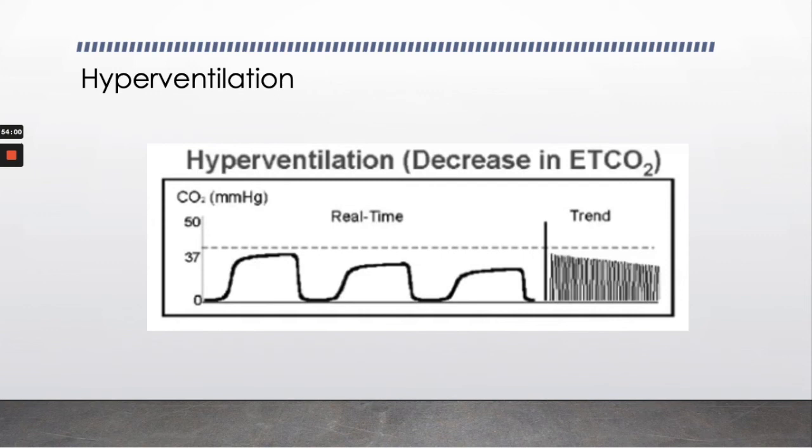And as we talk more about equipment and the differences between the different sizes of an LMA, you'll have some patients that sit in between, like maybe a 3 and 4 if they're a woman, and if they're a man, they could sit between a 5 and 6. That could make it more difficult for it to seat and seal well, just due to anatomy also.